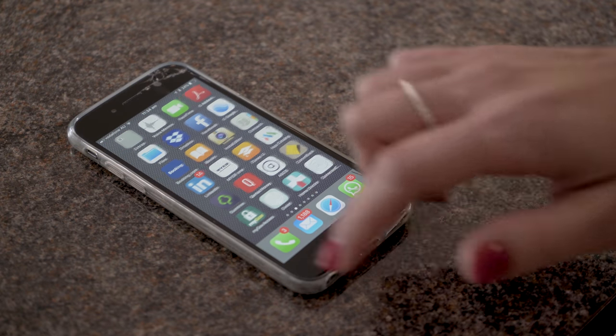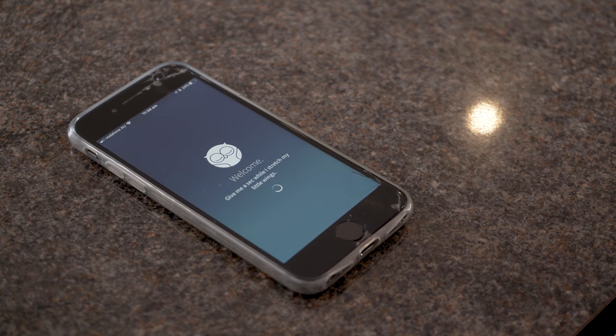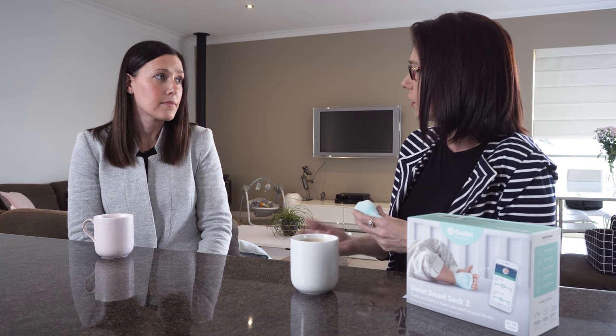The linking to the phone part I love, because we're all on our phone all the time. A lot of data comes through and you can look at the historical data.